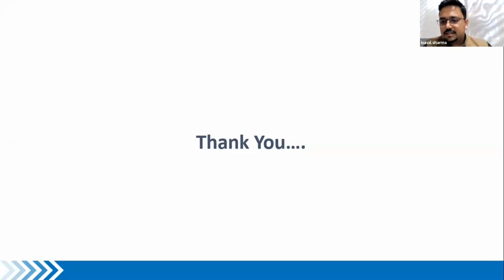Any thoughts, Abha ma'am, on this case? No, let's move on to the next case.